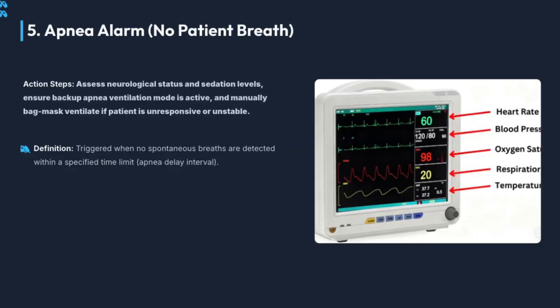The apnea alarm triggers when no spontaneous breaths are detected. Assess neurological status and sedation levels. Ensure backup ventilation is active, and provide manual ventilation if the patient is unstable.